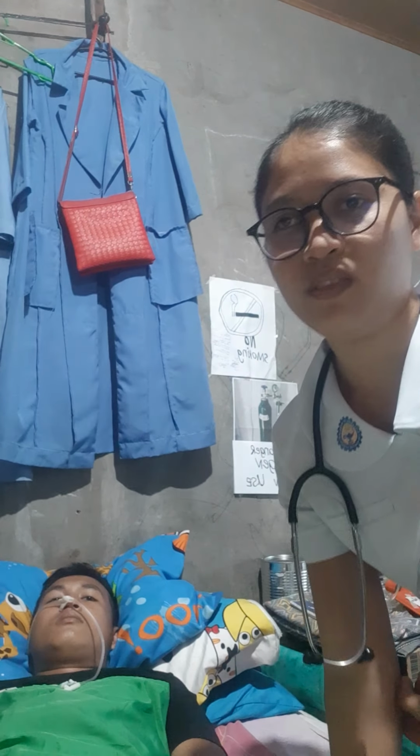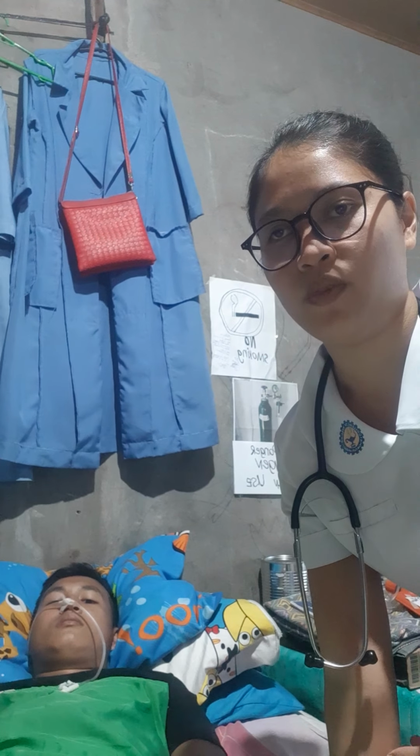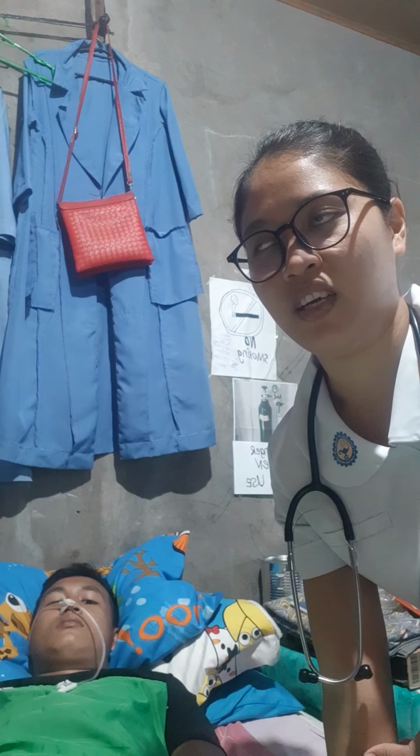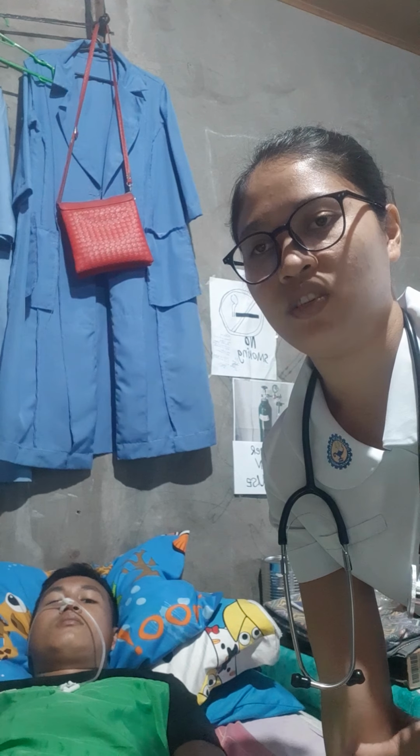And today I am going to demonstrate administering a tube feeding. The purposes of this procedure are to restore or maintain nutritional status and to administer medications to the client.